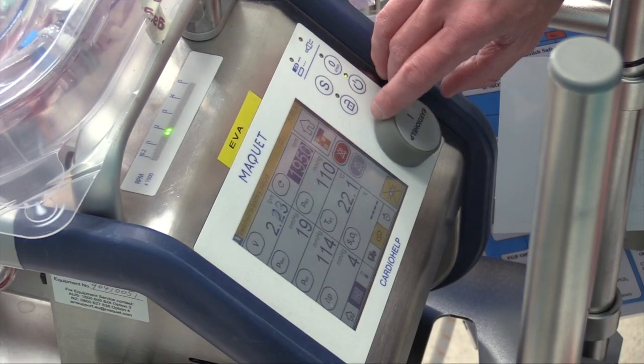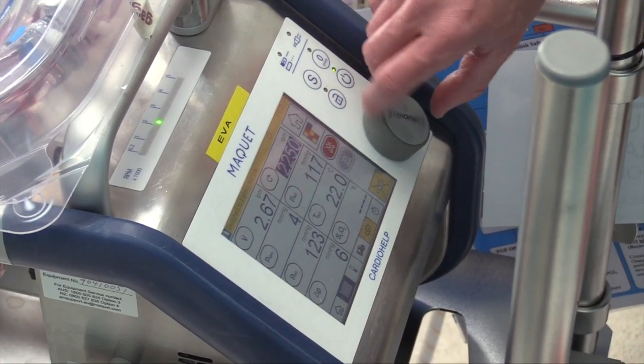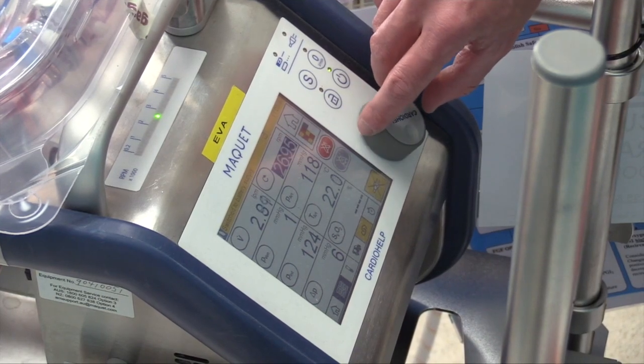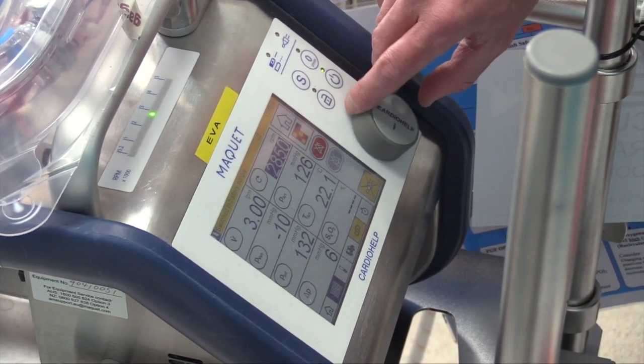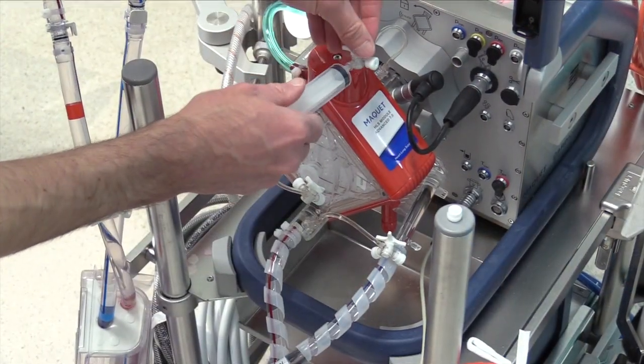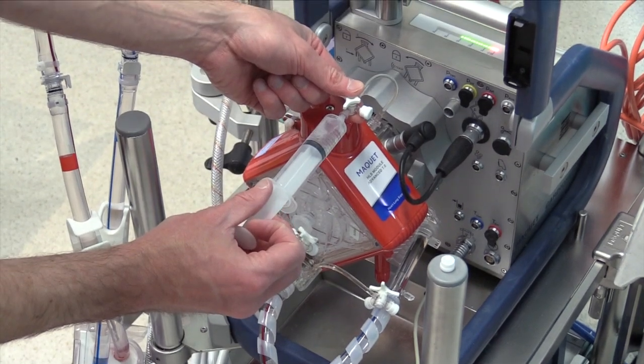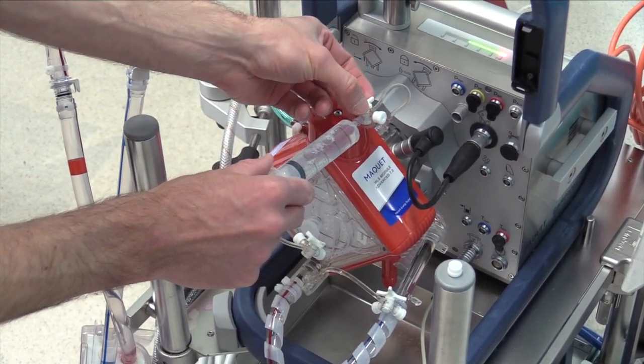Wait for priming to occur. Now run the pump at around 3000 rpm for at least two minutes, and then 4000 rpm for an additional one minute. Purge all of the three-way taps using your 20ml syringe. Ensure all air is removed from the circuit — no air should be visible and the pump should be virtually silent.